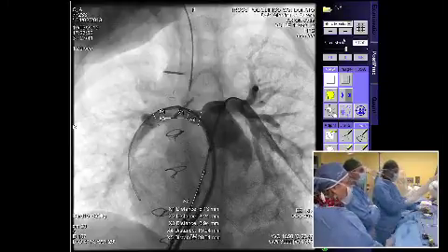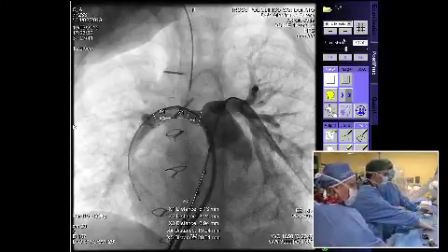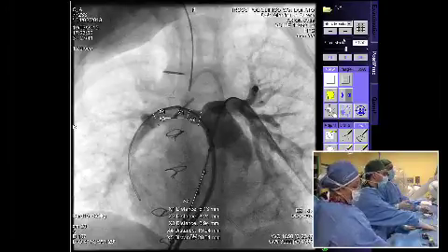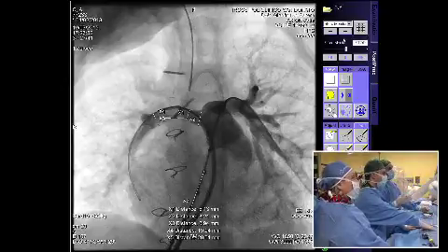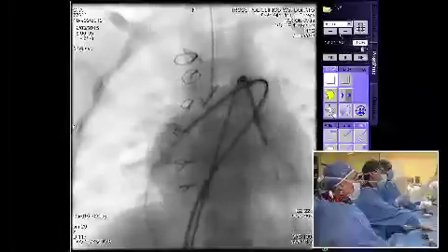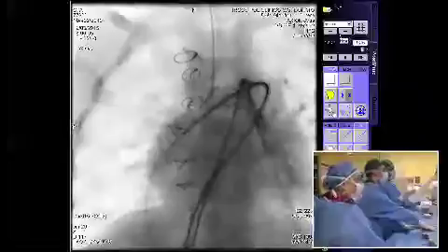And if you go to the last injection I've done, last angiography, again, I think that we have a lot of room for a stent in the right PA, and we could just put the second stent at the origin of the left PA. And I think that there is much room for PV implant in the future, but pulmonary valve is not a problem.